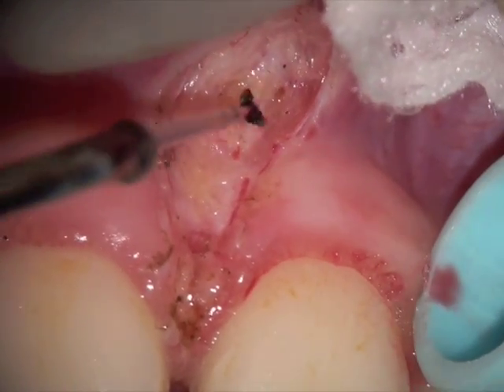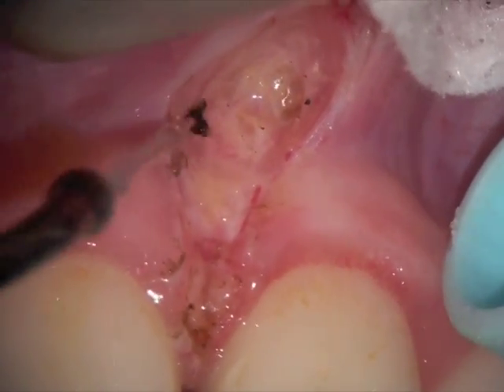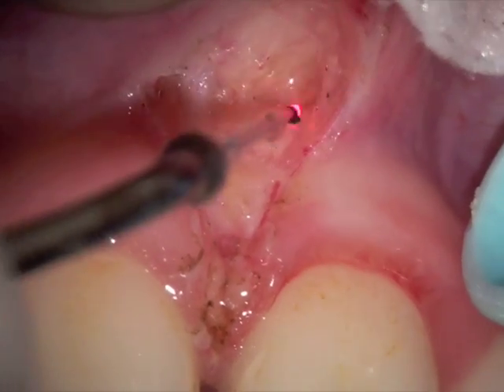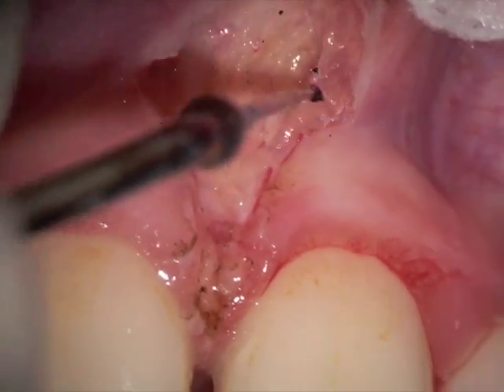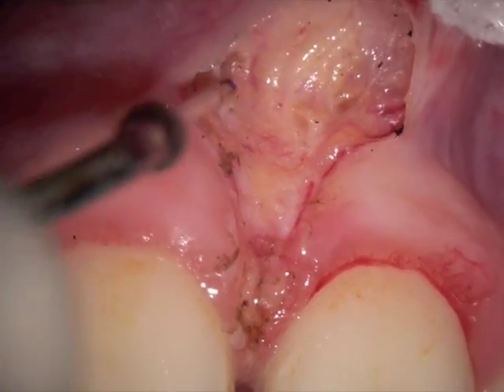We should remove this coagulant periodically to prevent it from building up in the tip. By dragging in a horizontal fashion across the area, we're able to remove the fibers down to periosteum, and without any significant bleeding — hemostasis is under fairly good control.